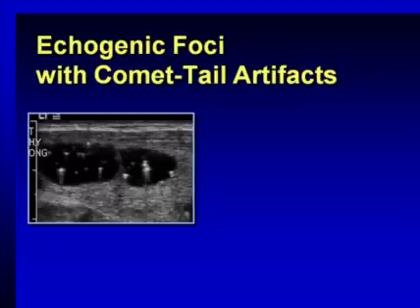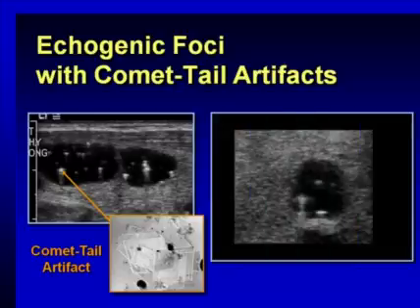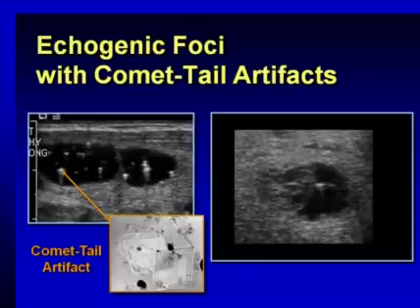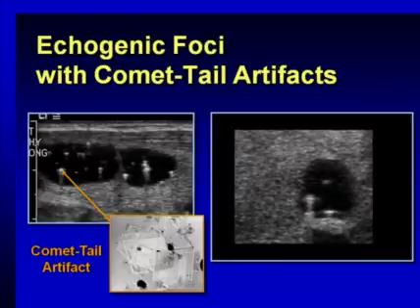It's probably some sort of crystalline material or other material giving this reverberation artifact, much like the cholesterol microcrystals that are seen in the gallbladder and give a similar type of Comet-Tail or reverberation artifact. One can perhaps best see this in real time, where we see the echogenic foci here within the fluid and posteriorly the reverberation artifact or Comet-Tail.